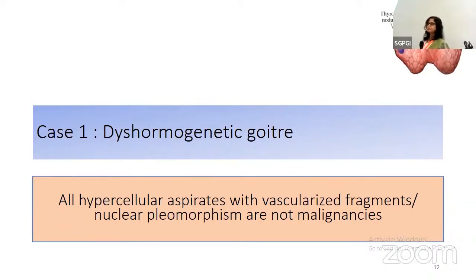So you have to always go back. In fact, the patient may be euthyroid also. It may be an undiagnosed case, and it may present with a thyroid nodule. There may be some colloid. So it has different stages of aggressiveness depending upon the severity of the enzyme defect. Category 2. So now that we have the clinical and ultrasound findings, we can go back and call it category 2.